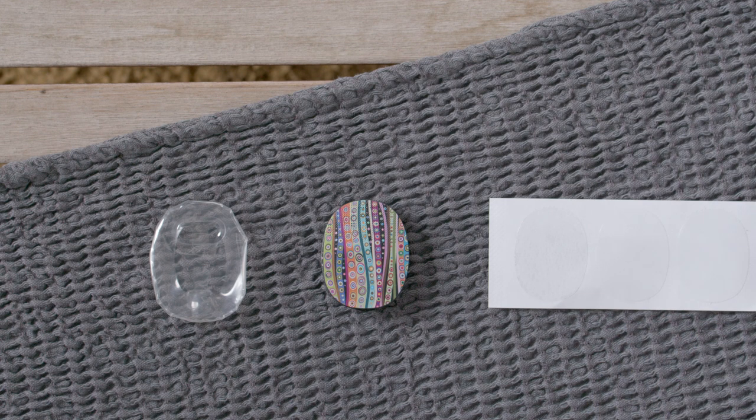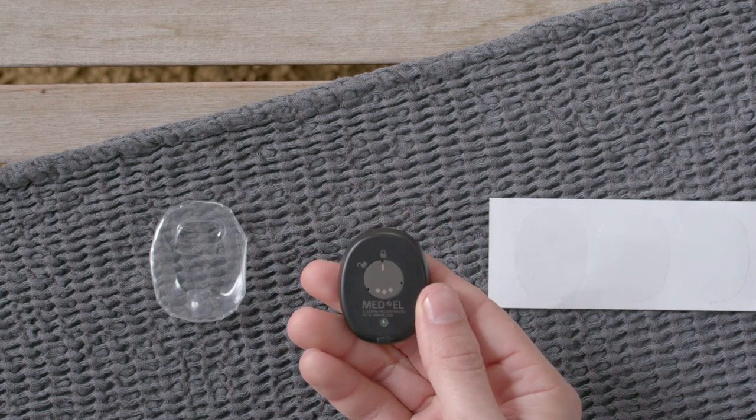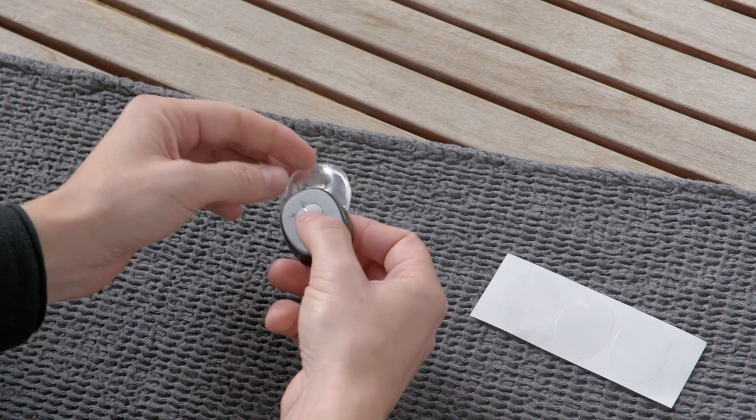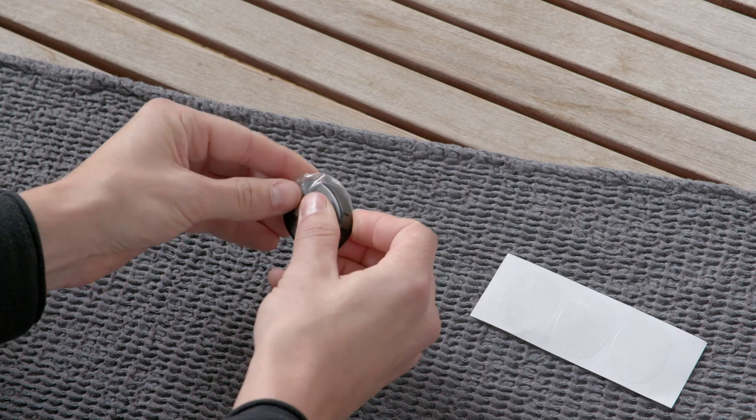To attach waterware to your RONDO3, first make sure your hands are clean and dry. Hold RONDO3 with the MED-EL logo facing upwards. Insert RONDO3 into waterware by placing the end with the padlock symbol into the side with a rectangular flap.